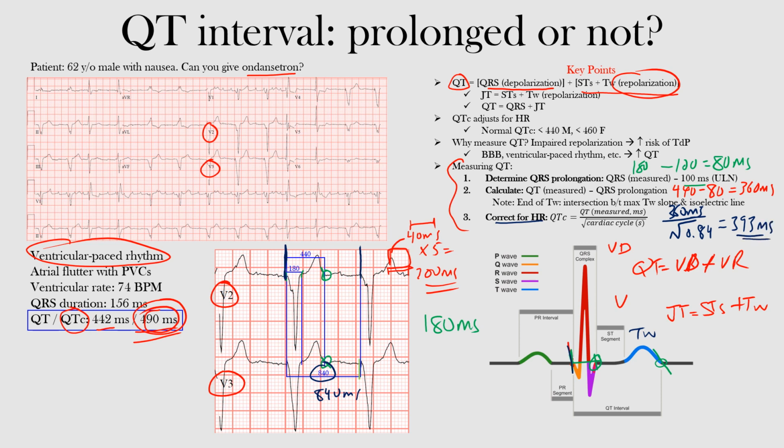So why is that? Well, you could actually do 360 milliseconds or 0.36 seconds, so you could do 0.36 seconds over the 0.84 seconds as well, but then you'd have to multiply by a factor of 1,000. So either way you can get that. Just know that if you use seconds throughout, you have to multiply it at the end by 1,000. If not, you can use milliseconds on the top and seconds on the bottom, and you'll get this, okay?